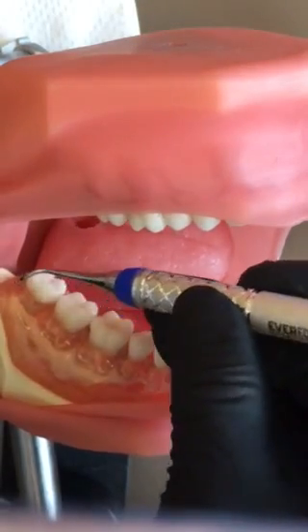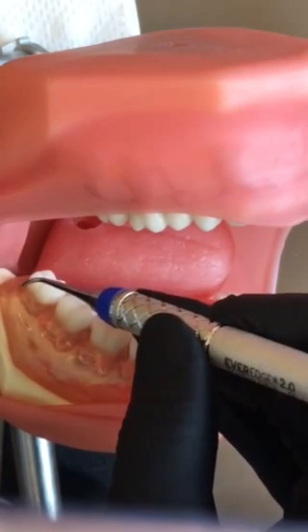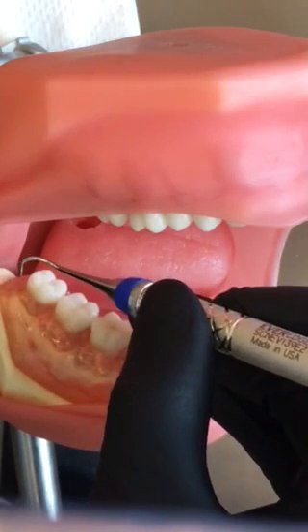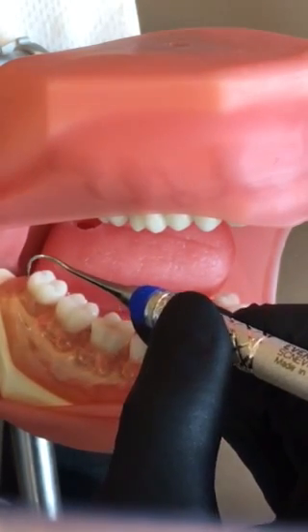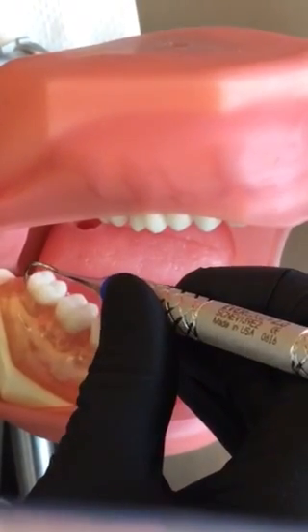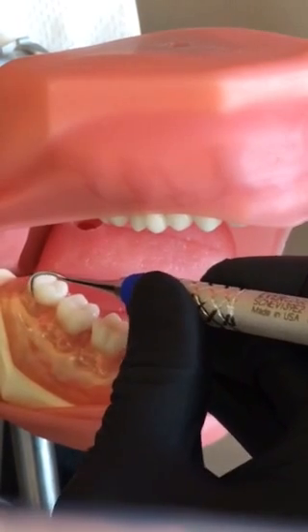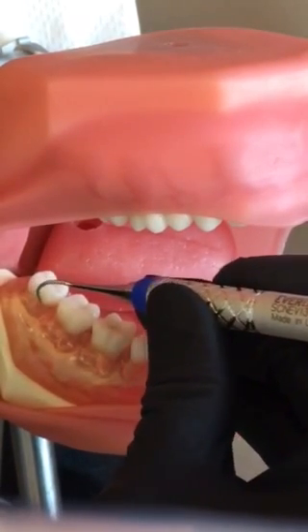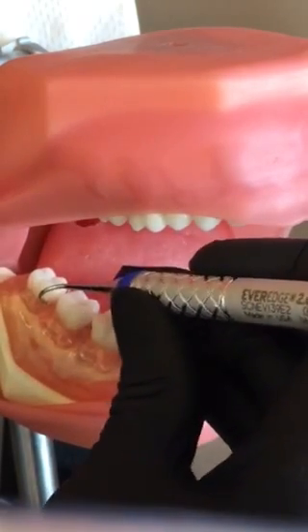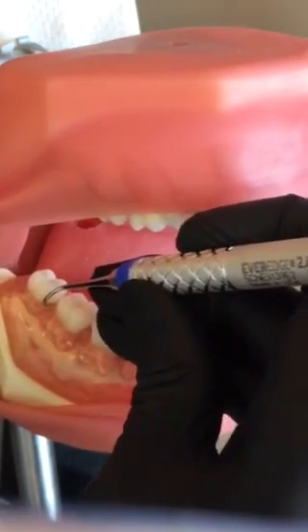I'm going to do the distal line angle, leaning toward the tooth to maintain a 70-degree angulation. Around the distal — I'm going to roll, leading with my tip and only using the lower third of the tip, which lasts about 2mm. I'm going to start at my distal line angle, lean toward the tooth, and make short overlapping oblique strokes across the buccal, then roll across the mesial, standing back up on my fulcrum to make sure I'm maintaining 70 degrees.